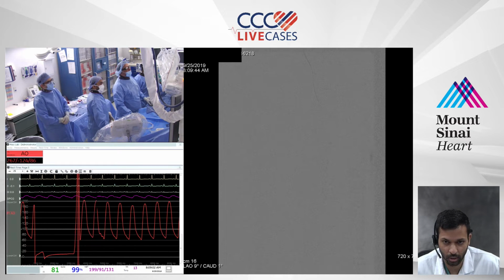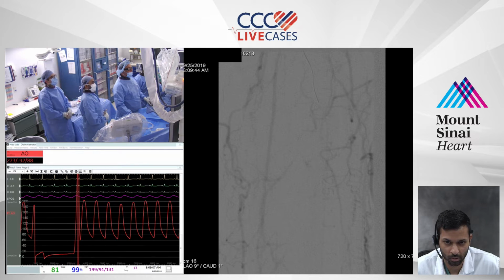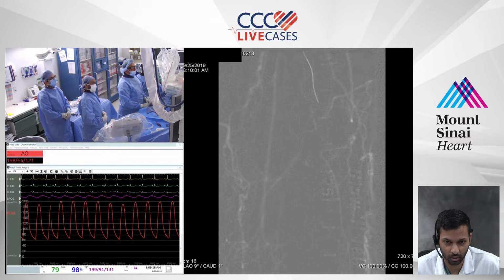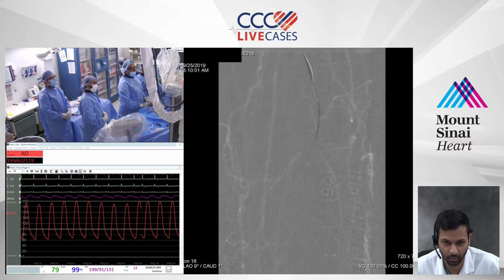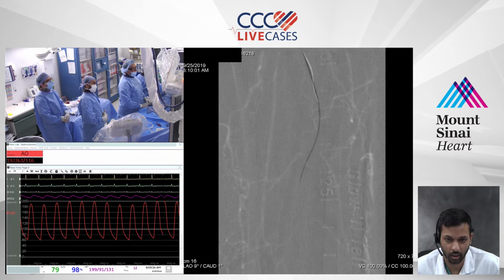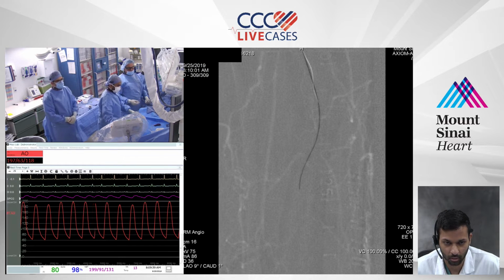In terms of the angiogram, though, I think that's an important component. So someone that just has a focal stenosis in their femoral artery probably doesn't have rest pain. Usually it's multi-level disease. So this patient has multi-level disease and his angiogram's clearly consistent with someone that could have rest pain. Additionally, I think non-invasives are important to quantify it a little bit more. So, getting ABIs and PVRs and just seeing what they are, which can differentiate mild, moderate, and severe disease. That's a great point.